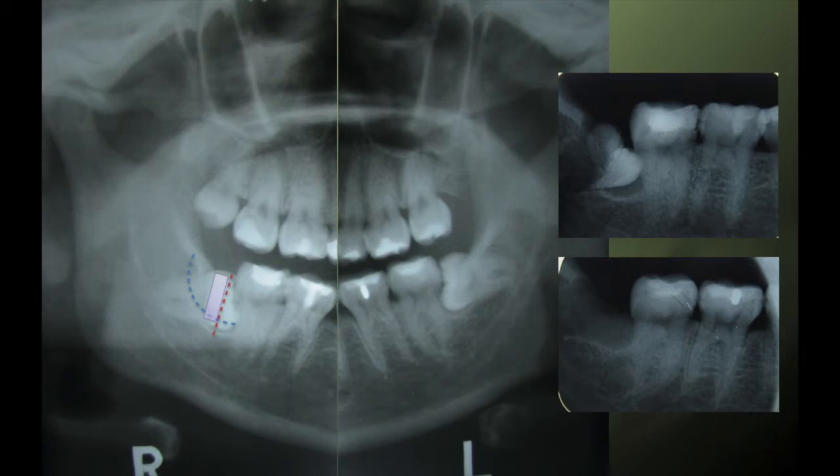Now, how was this possible? Just looking at this particular diagram, the width of the sectioned portion of the tooth was actually the same as the window that I had actually created. Initially, this gave me an idea that I might have just flicked off or suctioned off that small portion of the tooth.